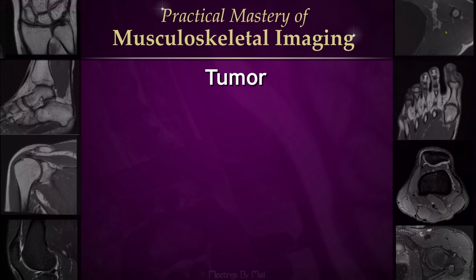We're going to start with location, and that means obviously what body part, but also what compartment it's in, if that's possible, especially if it's going from one compartment to another. That's absolutely critically important. And sometimes you'll see references divide compartments up, and that might be overly complicated. I think you can keep it simple and just give a general idea. Is it in the anterior, the posterior compartment? And this is done by looking at atlases online.